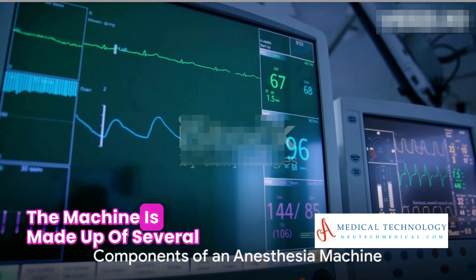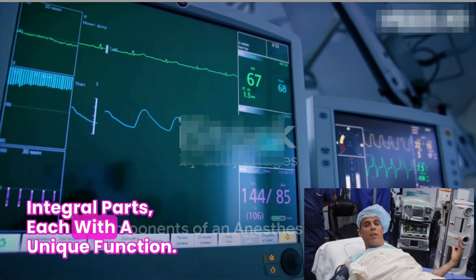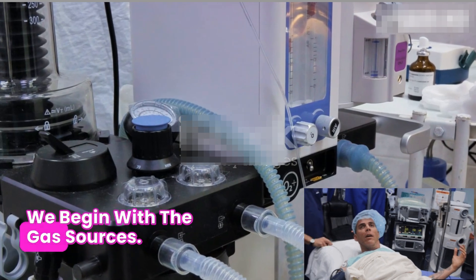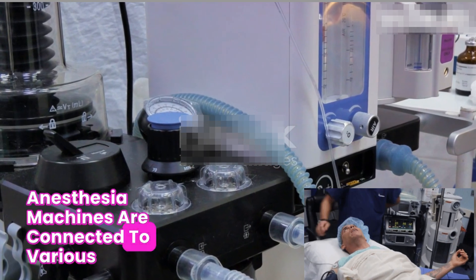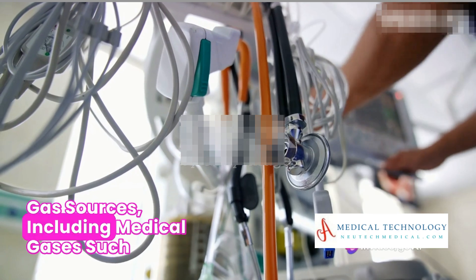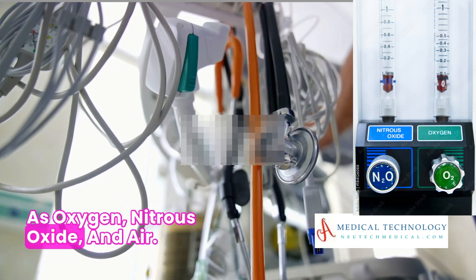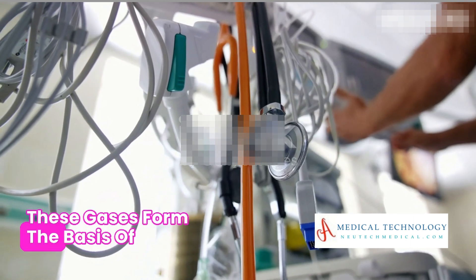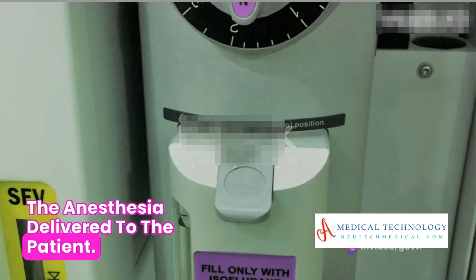The machine is made up of several integral parts, each with a unique function. We begin with the gas sources. Anesthesia machines are connected to various gas sources, including medical gases such as oxygen, nitrous oxide, and air. These gases form the basis of the anesthesia delivered to the patient.